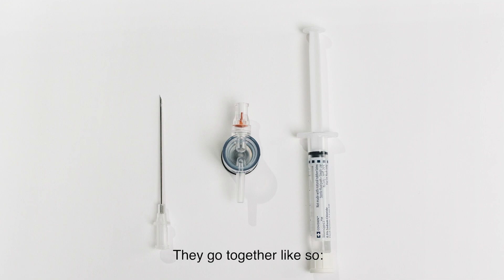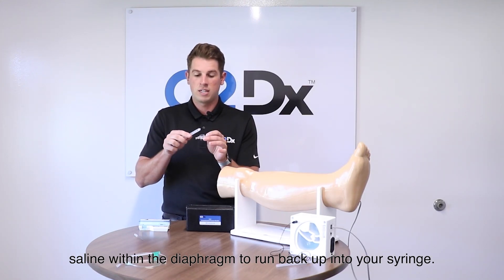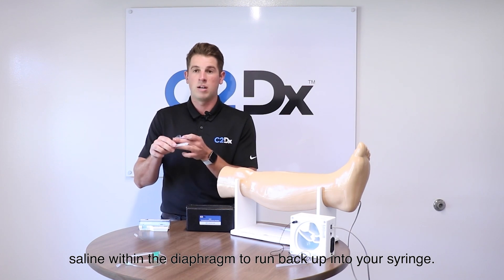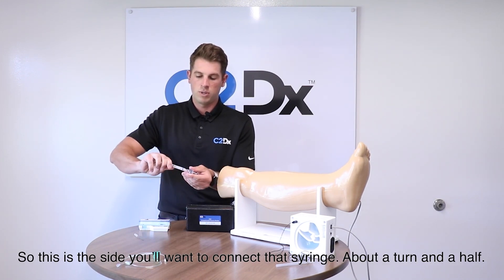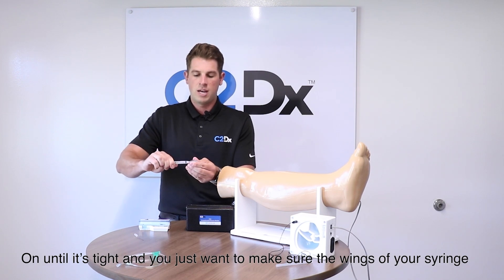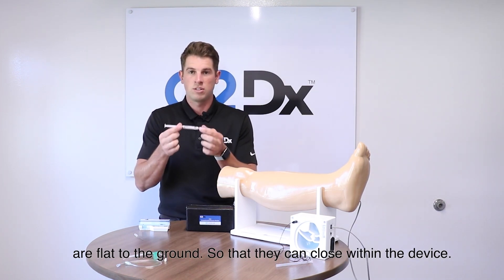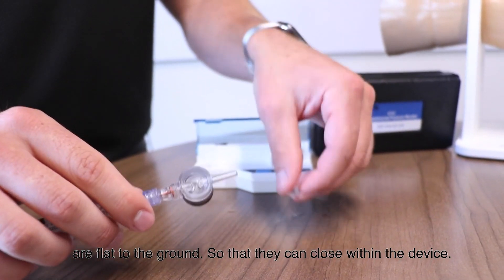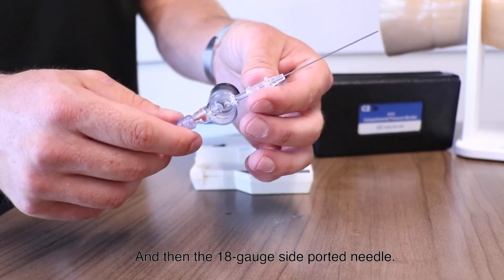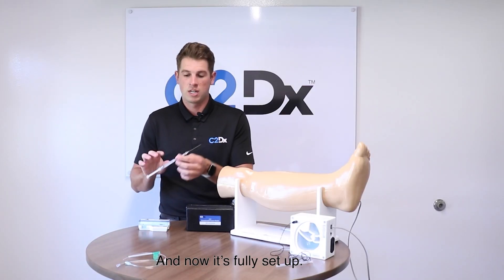The three components go together like so. On the diaphragm there's a red luer lock that doesn't allow any of the saline within the diaphragm to run back up into your syringe. Attach the syringe about a turn and a half until it's tight. Make sure your wings or syringe are flat to the ground so they can close within the device. For the 18-gauge side-port needle, I recommend the bevel facing down. Now it's fully set up.